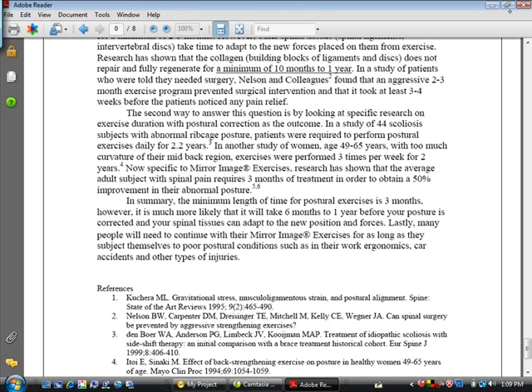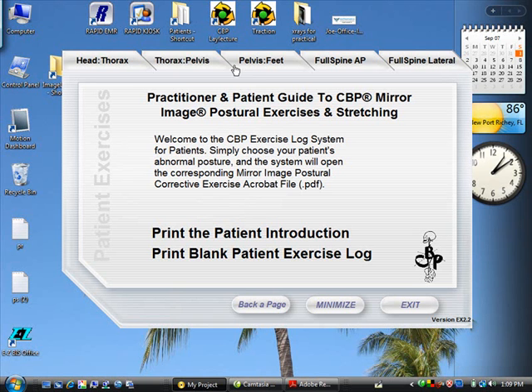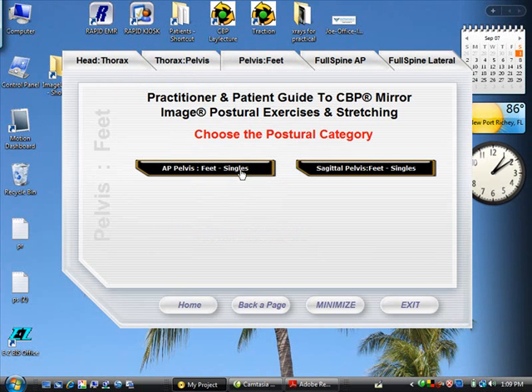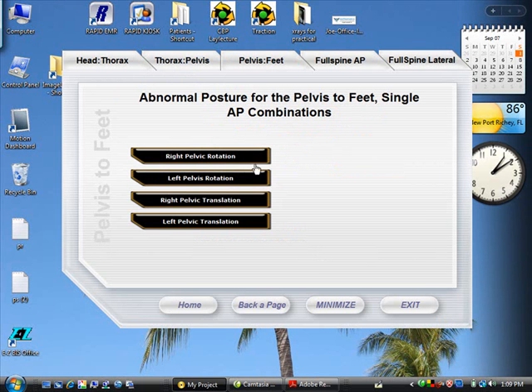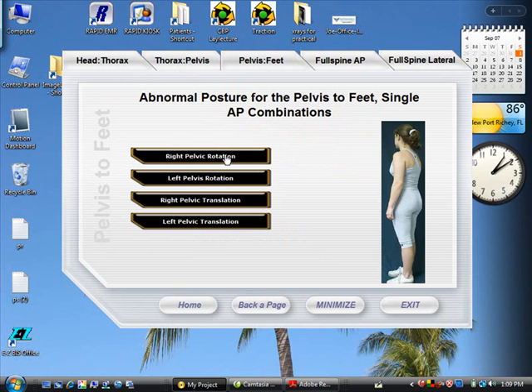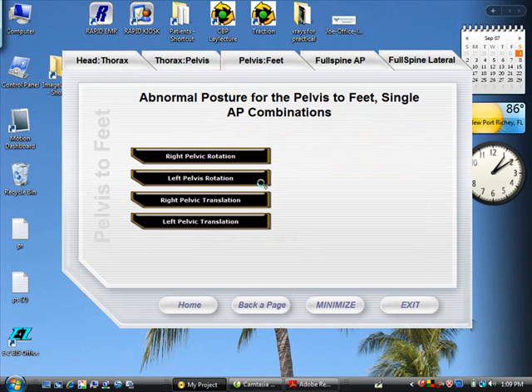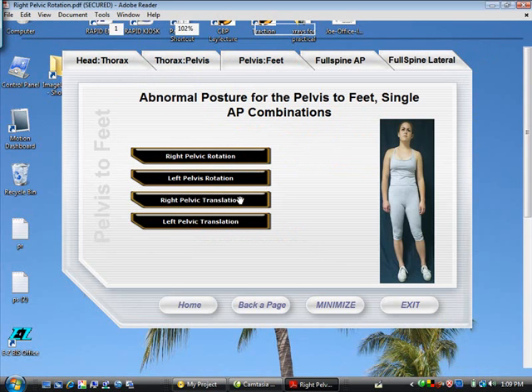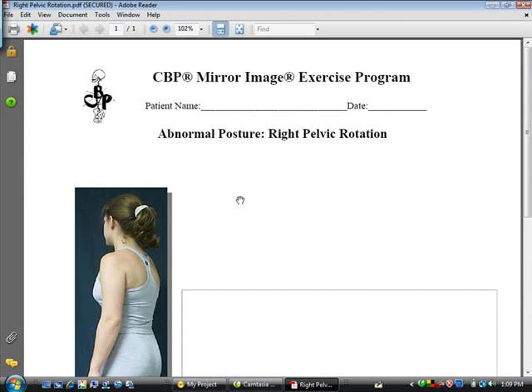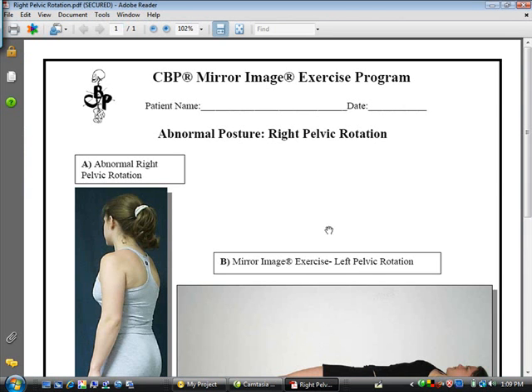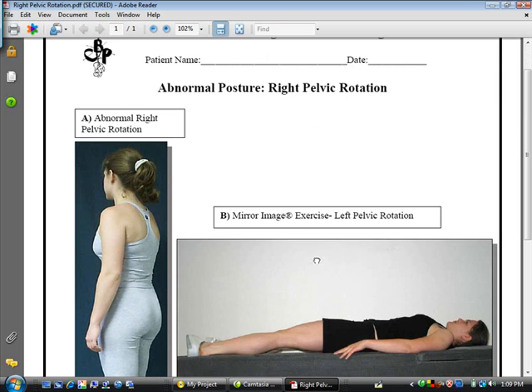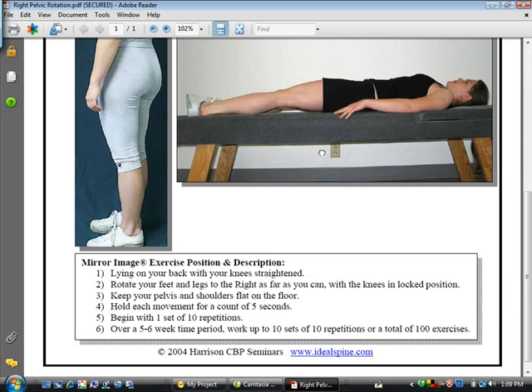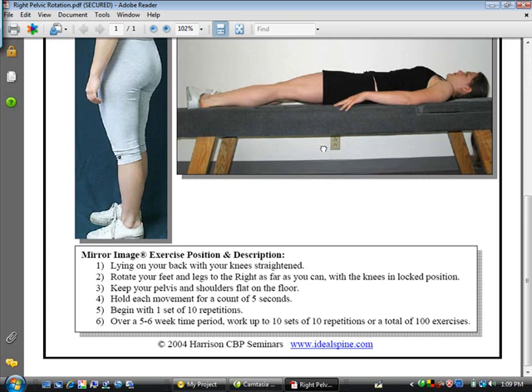Let me go ahead and minimize this again and show you. You simply choose the abnormal posture — so if they have a pelvis-to-feet abnormal posture, go through the singles, say they have a right pelvic rotation — I'll go ahead and open up their corrective exercise. You can see right here — I apologize, my computer is a little slow because I'm doing a screen capture video — it tells you how to do the exercises.